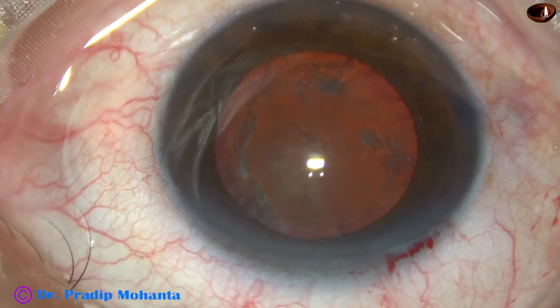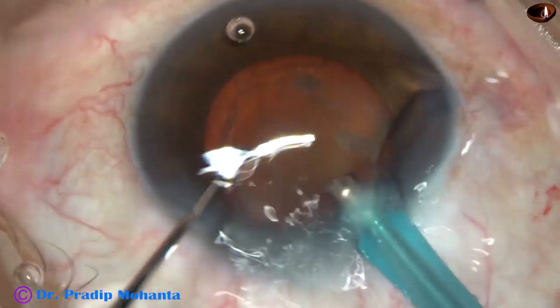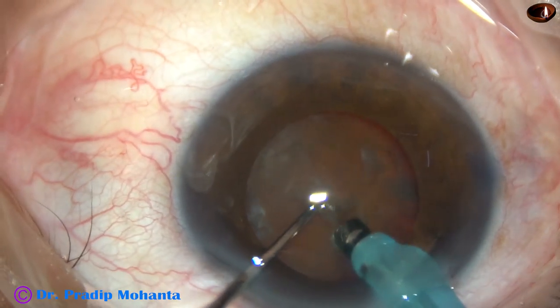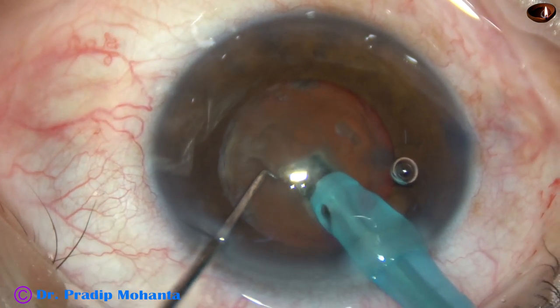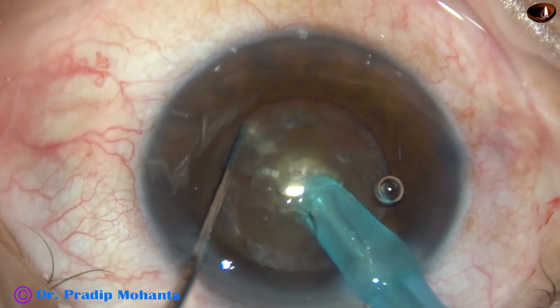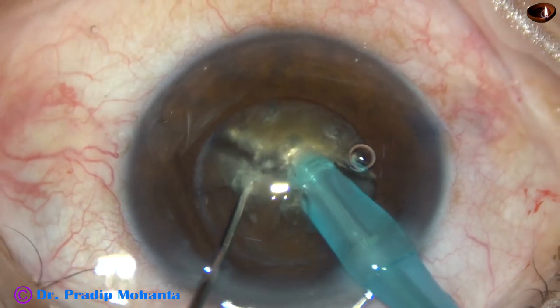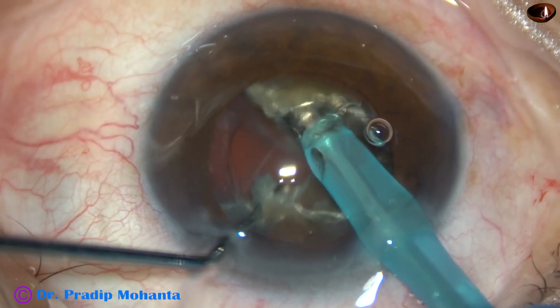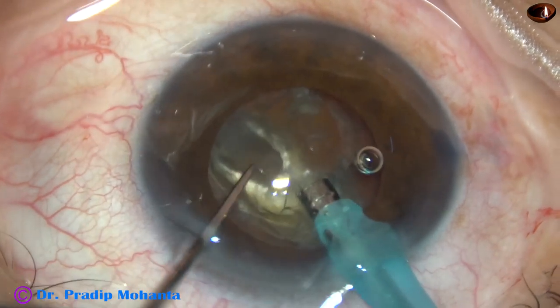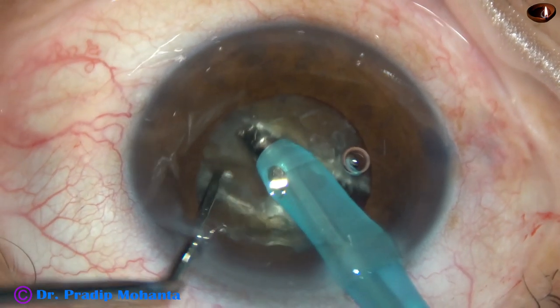The tip of the FACO handpiece has been exposed a little more so that I can do direct chop in this case. This is what I call submarine chop. The nucleus is pushed a little downward, and the tip goes into the substance of the nucleus, moves through the nucleus towards the opposite equator. As it reaches near the opposite equator, the chopper is used to divide the nucleus into two halves. It is rotated 180 degrees so that the two hemi-nuclei separate completely from each other.